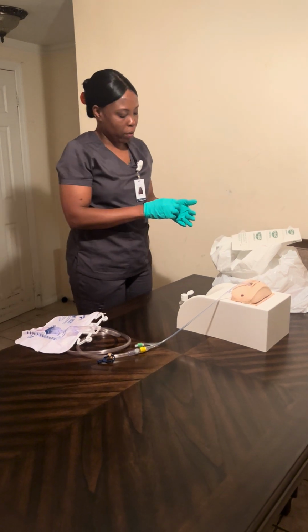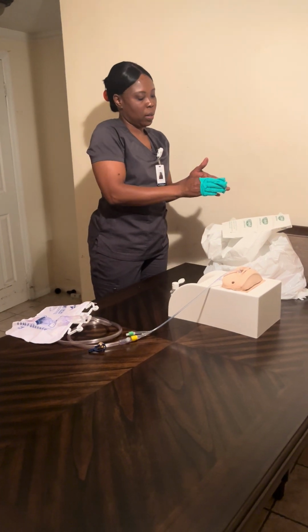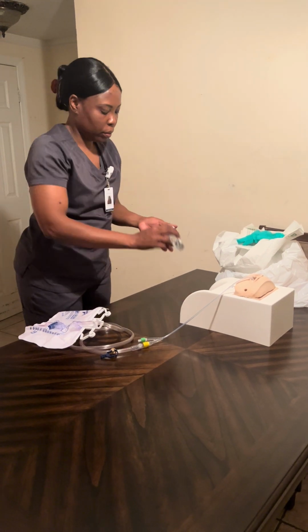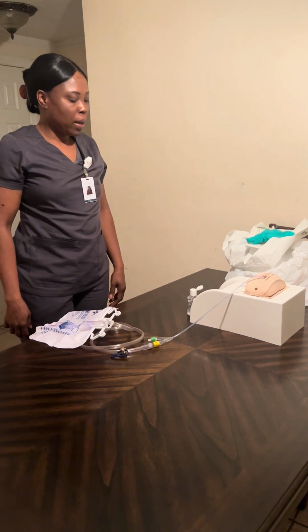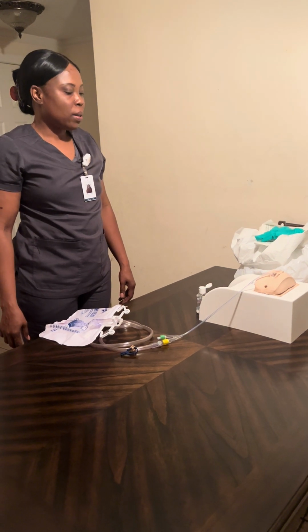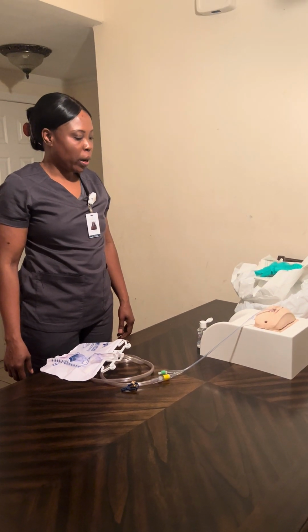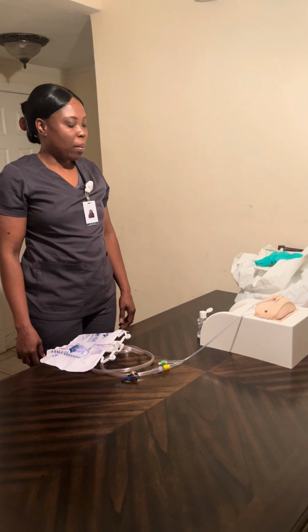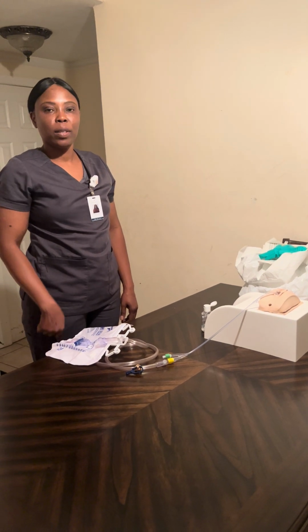Now I'm gonna remove my glove, turn it inside out. Use my 2 fingers, turn it inside out. Now I'm gonna use hand sanitizer to wash my hand. Mrs. Smith, I'm gonna make sure my patient is positioned comfortably. Mrs. Smith, if you feel any pain, please let me know. I'm gonna come back to check on your drainage. If you have any questions, please let me know. Now I'm gonna document my result. I'm gonna close the curtain, give my patient privacy, and leave. Thank you.